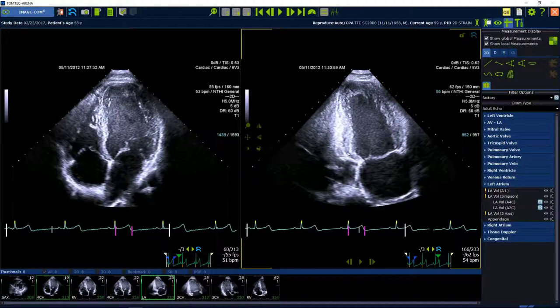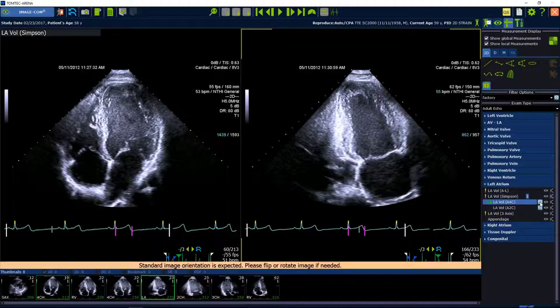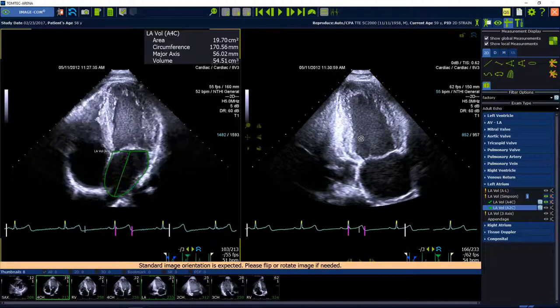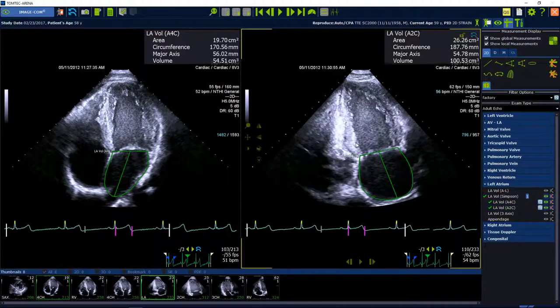Now start the analysis with the automatic detection button and tell the software where to find the four-chamber view and the two-chamber view.